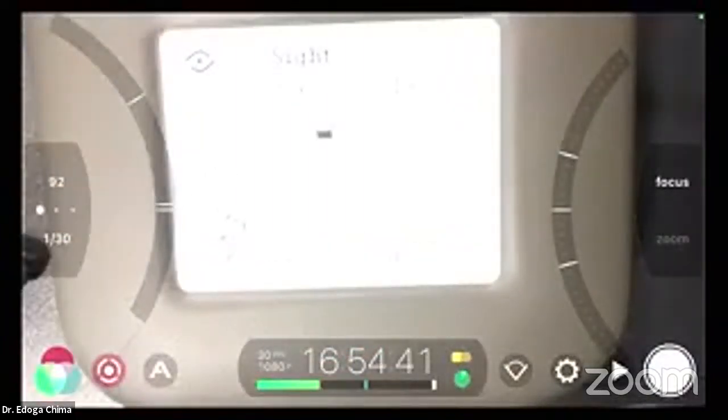And then I will focus this adapter to show us an idea of what I mean by focusing. If we notice, this picture is not clear because it is overexposed. You can't make out the details of this adapter, the same way you will not be able to pick out details in the retina.